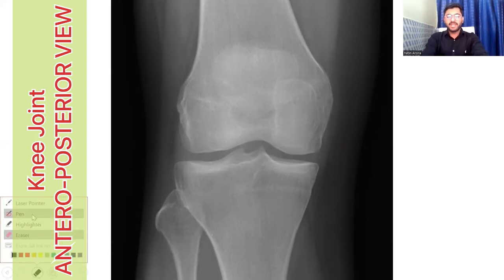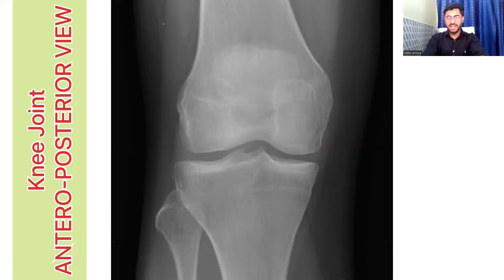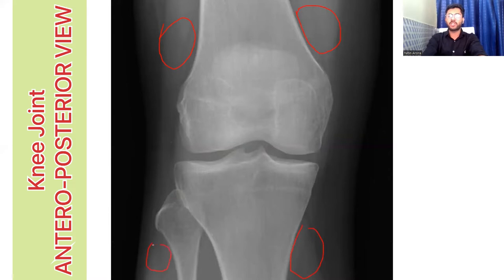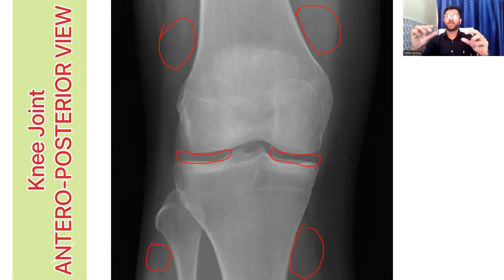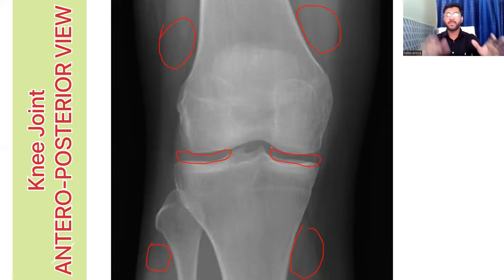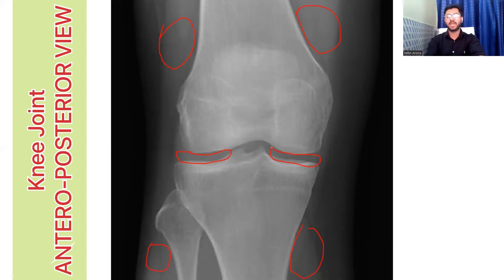The next thing you need to comment on in this x-ray are these gray areas — this gray area on this side and this gray area on this side. These are the soft tissues, that is the muscles around the knee joint. Above is the quadriceps muscle and below are the muscles of the lower leg. This gray area between the femur and tibia on the lateral side and medial side is the space for the articular cartilage and the meniscus — this is the place where the meniscus sits. The lateral meniscus on this side and the medial meniscus on this side.